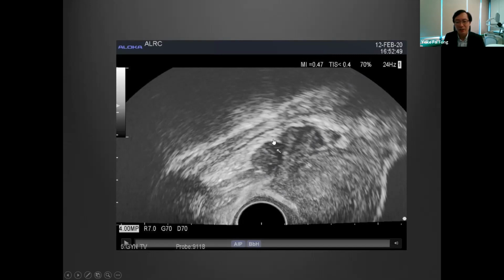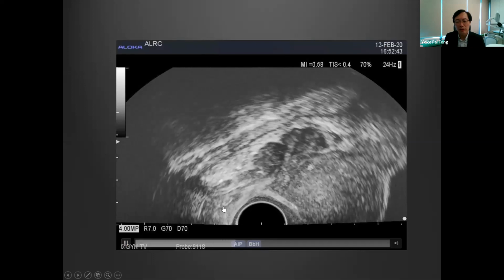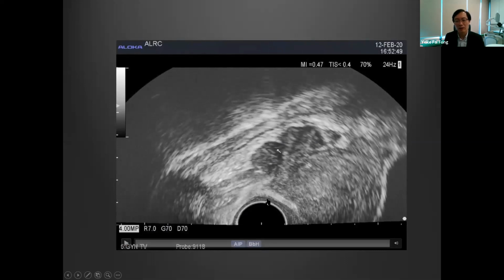Okay, you can see that there is a response of the submucosa. There's a whitening of the submucosa and thickening over here, probably as a response to fibrosis and inflammation also. So you can see the thickened submucosa over here, right? And this is the lumen over here. So I show you again. Lower rectum is okay, which I didn't show, right? But over here, this big nodule, right? And it's stuck, it's not mobile at all, right? Your uterosacral ligament is over here.